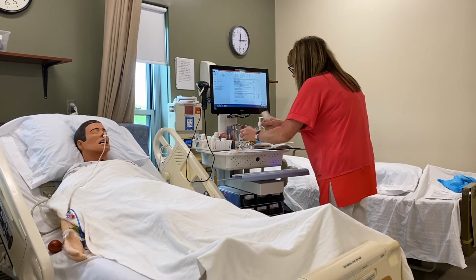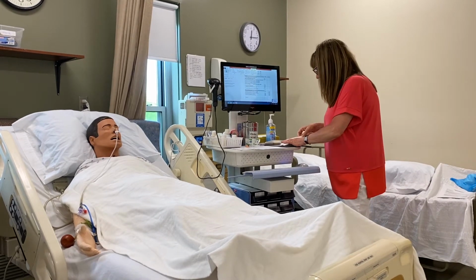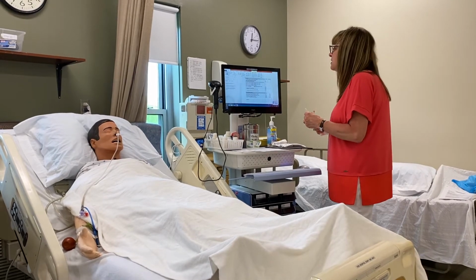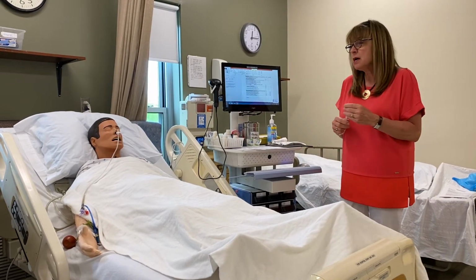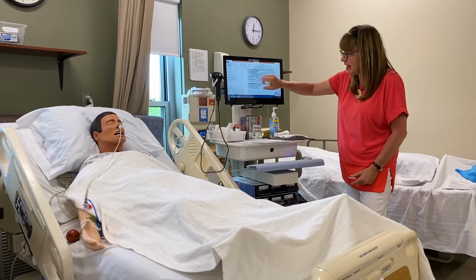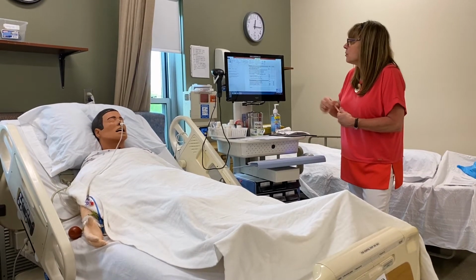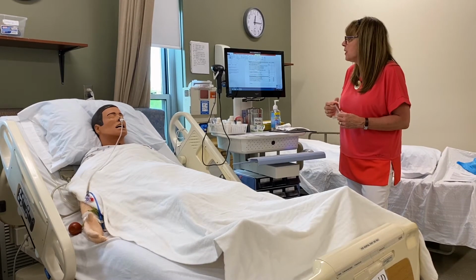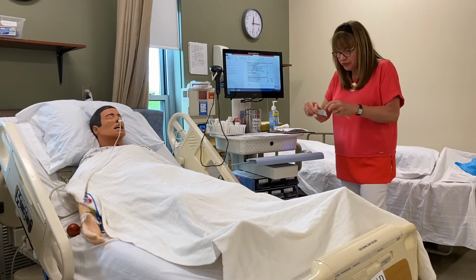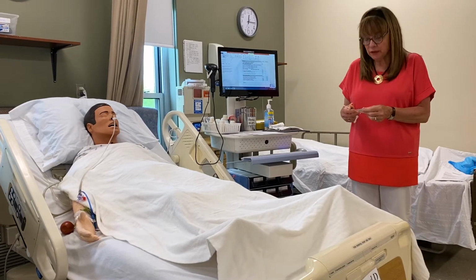So what we're going to do today is we are going to administer injectable medications to our patient. And we're going to give our patient 2 types of insulin just to demonstrate. Typically, we would probably just use rapid-acting insulin, but we're going to use our short-acting insulin and then our rapid-acting insulin utilizing a pen. We're going to be giving Lovenox, an influenza vaccine, and a Solumedrol injection IM. And we're going to also have Monique administer those medications, and I'm going to play the role of the faculty member.